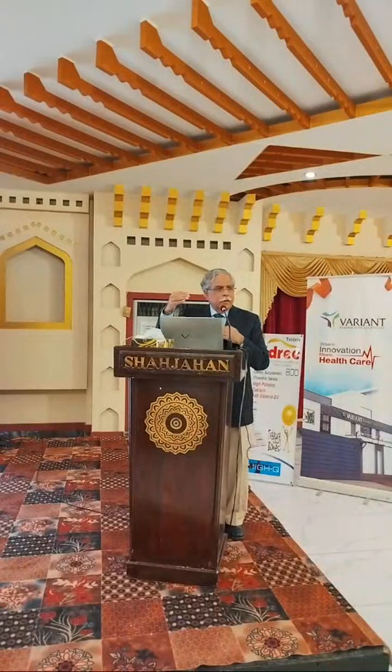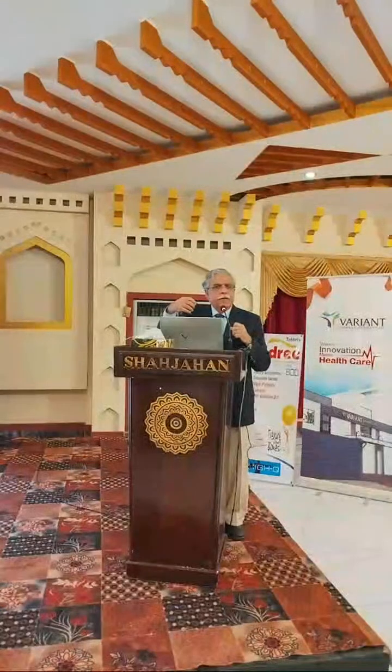So if you want, you can take a picture of this slide. It's how to actually get a good quality umbilical artery Doppler. I think a lot of us are doing it very casually, because it's so easy to see. We just see whatever we are seeing, whatever zoom we have. We just put on the Doppler. We don't care about the angles.